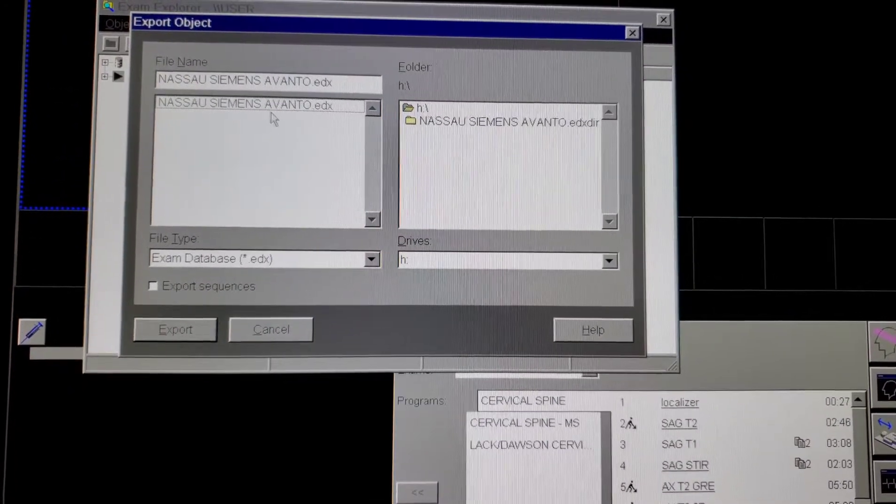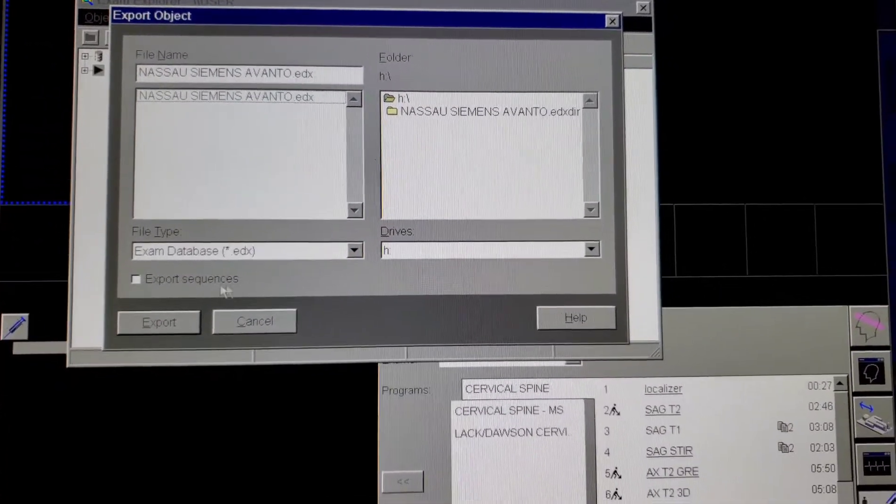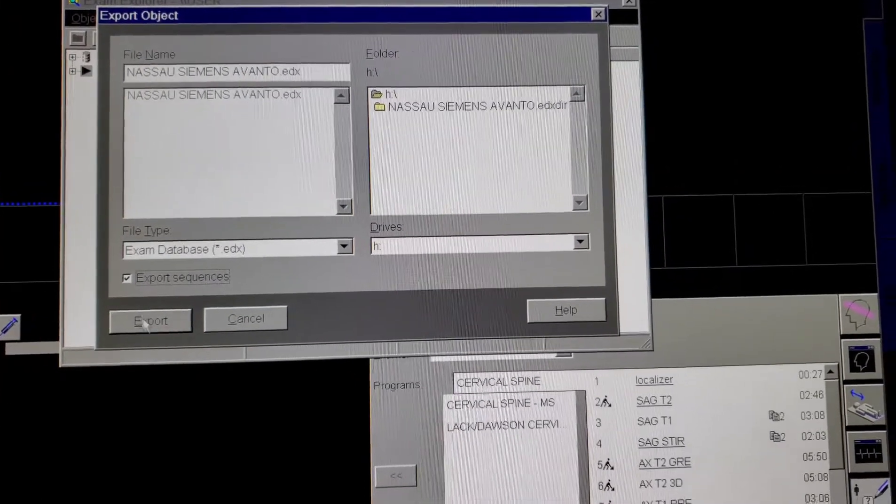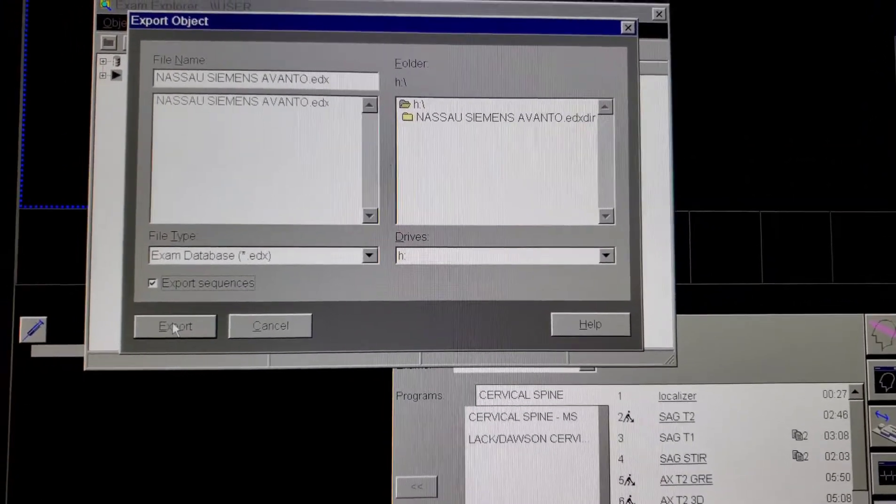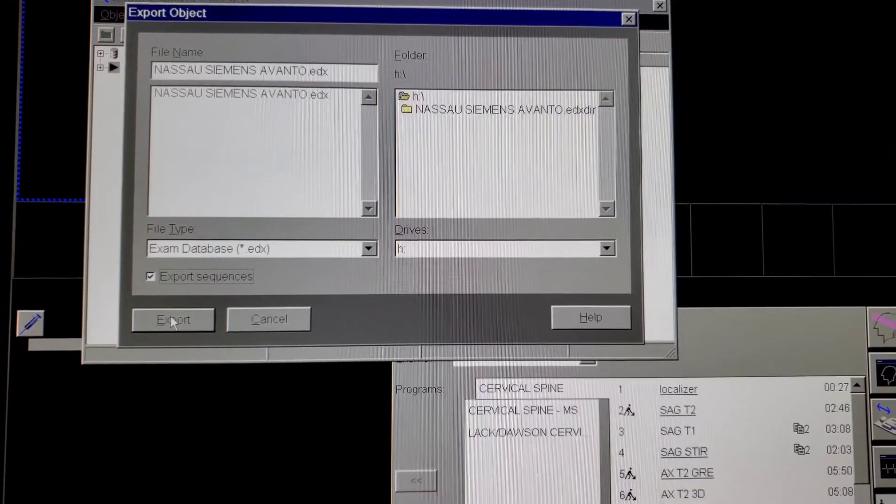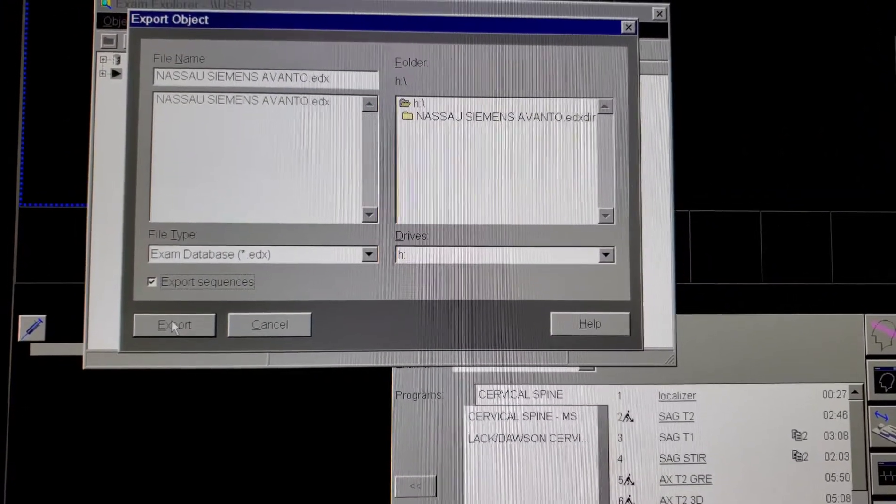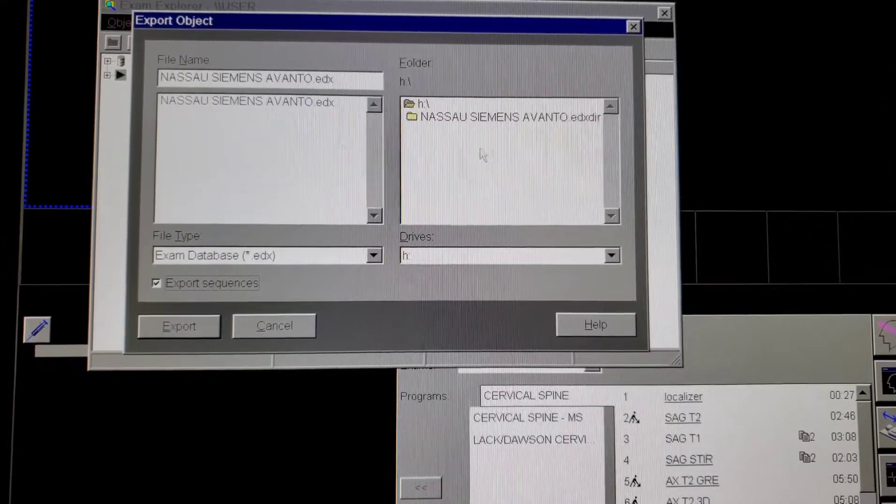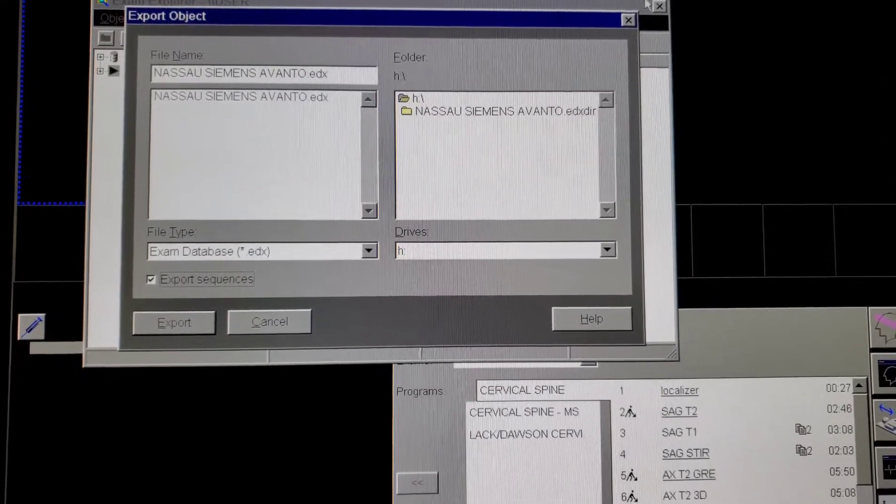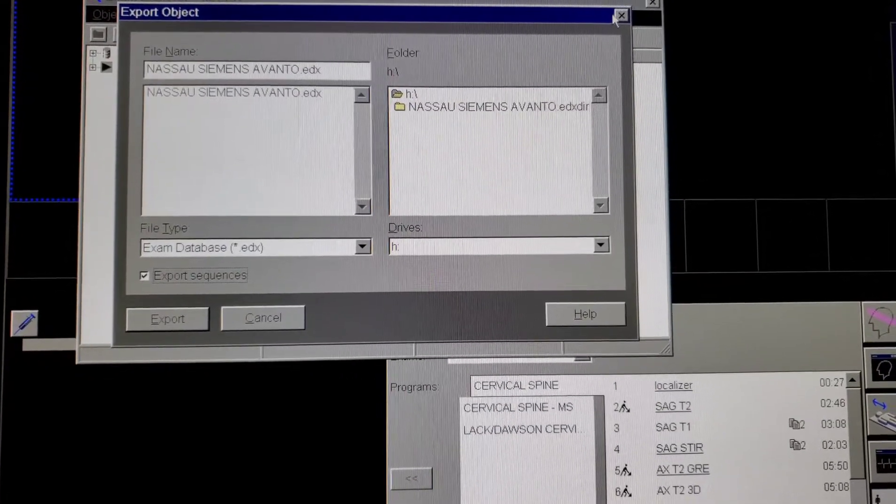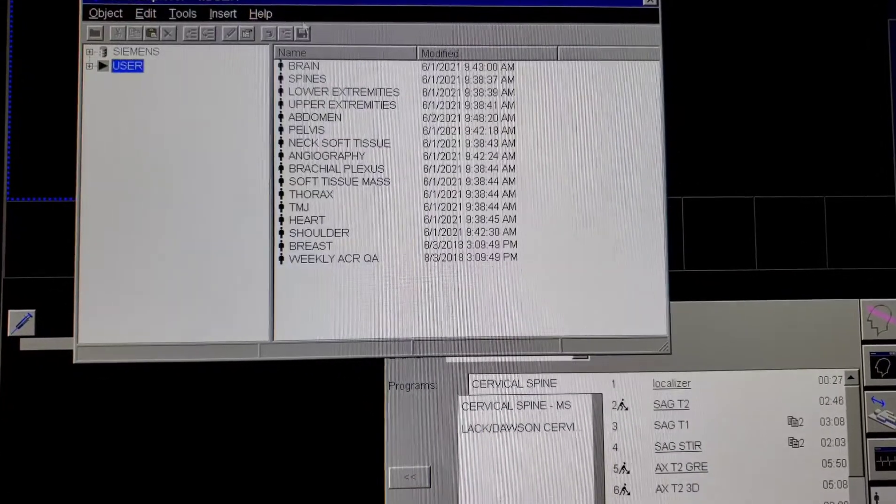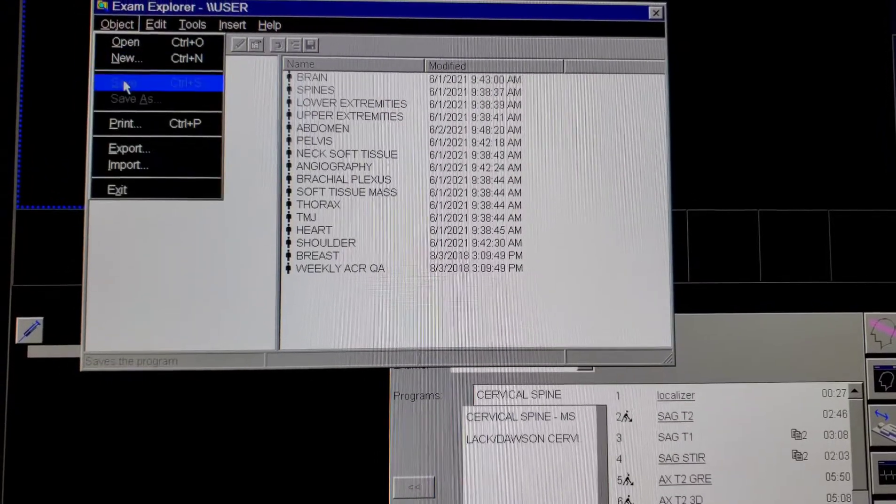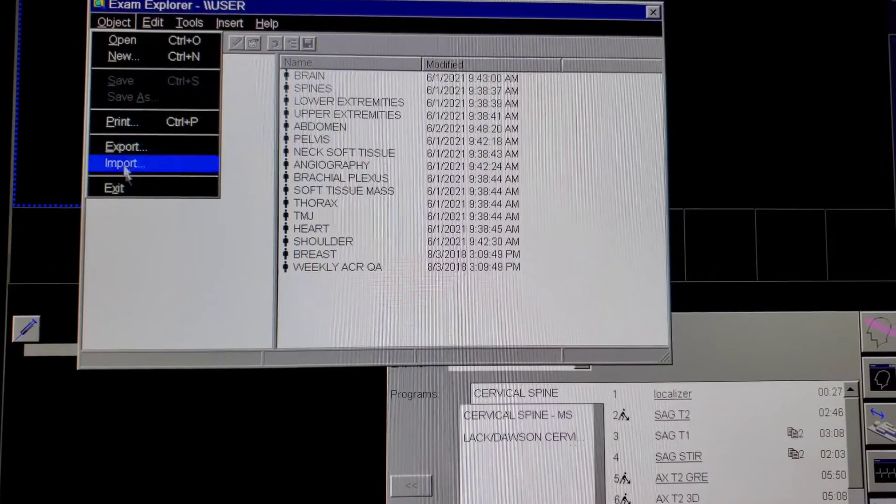Export sequences and then hit export. Takes about five minutes. Once it's done, if you come back and open it back up once it has been uploaded, you can just go to export or import and you will see the file listed here.